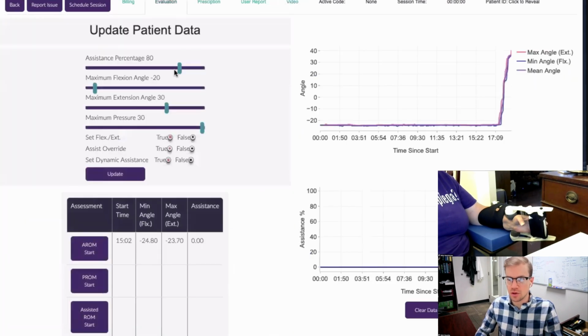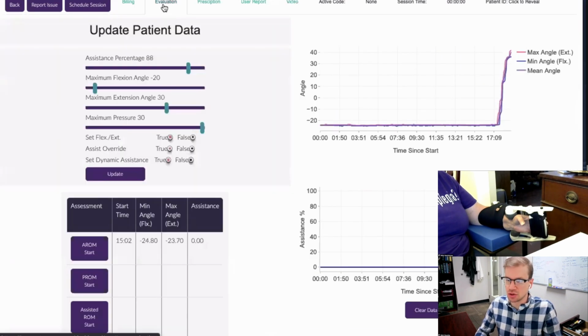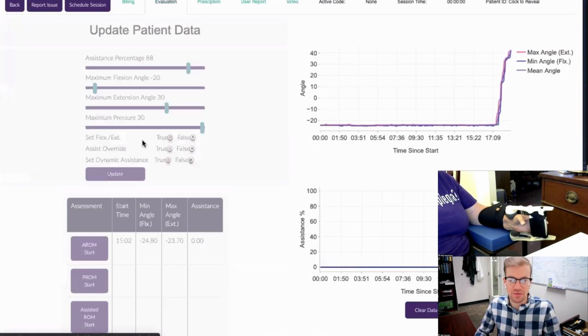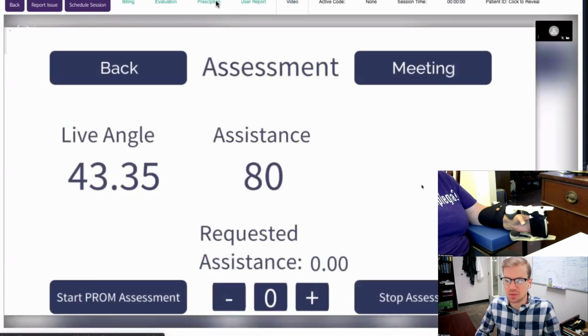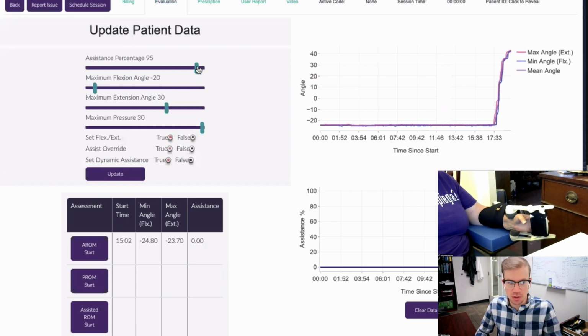Very good. And what we can do is go ahead and open up your eyes right now. I want you to appreciate how much you've actually moved. So yes, there is some significant impaired sensation there, Polly. This is one of the reasons why we would certainly want to leverage that visual information, because we can't rely on those normal proprioceptive or cutaneous sensations that give us some indication of where your body is in space. So I think that's going to be a key for you.